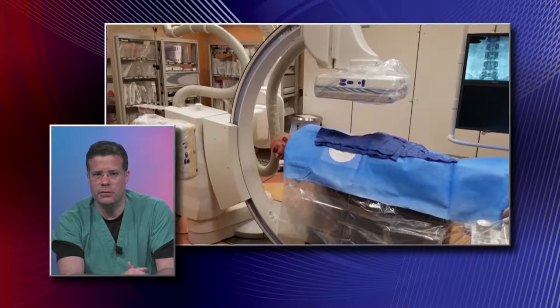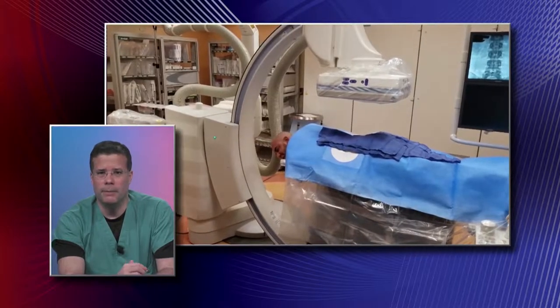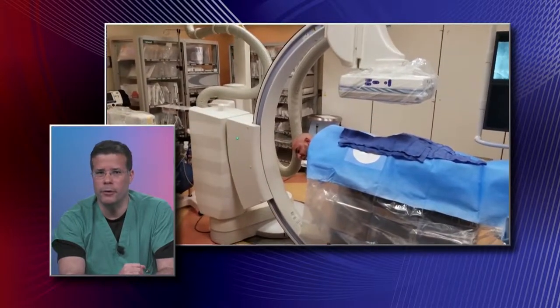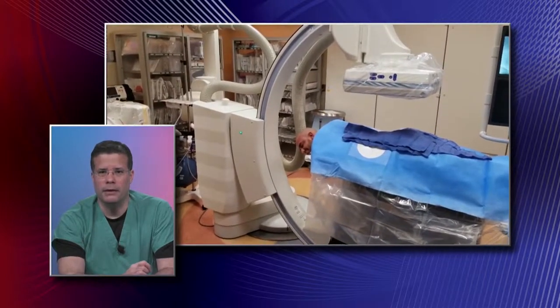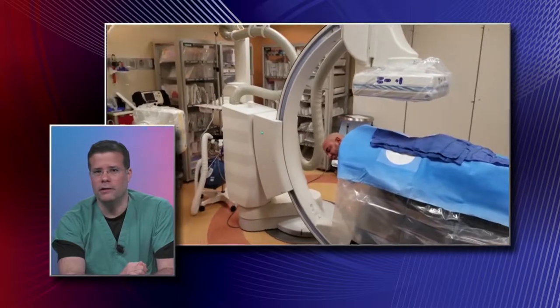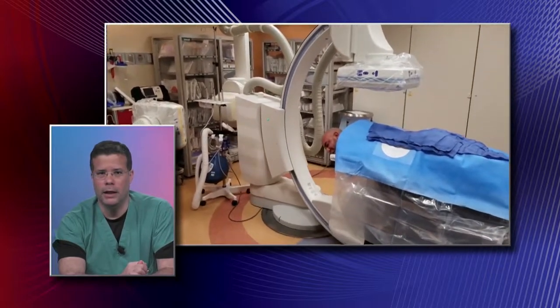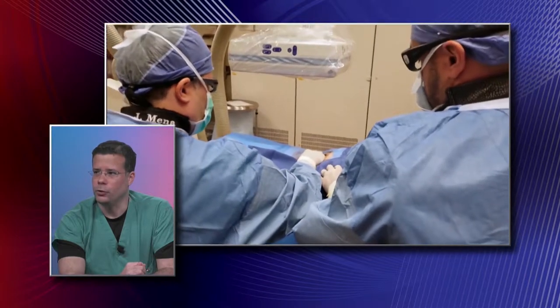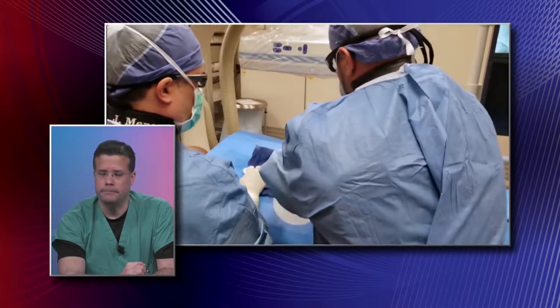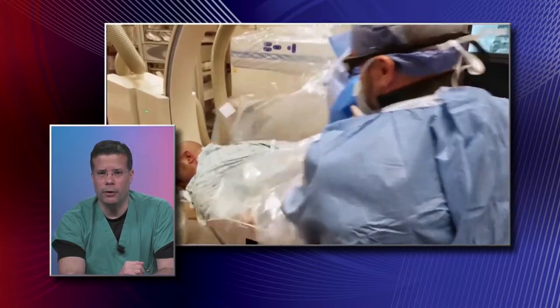The procedures themselves, on average, take anywhere between two to three minutes — they're quick. Right after the procedure, we expect the patient to feel relief from the procedure itself. Two to three minutes — yes, they're fast.